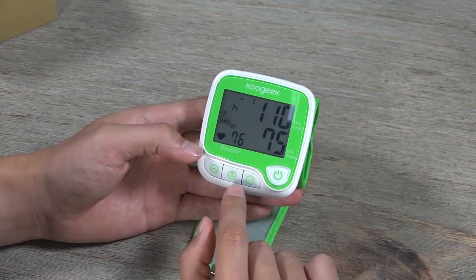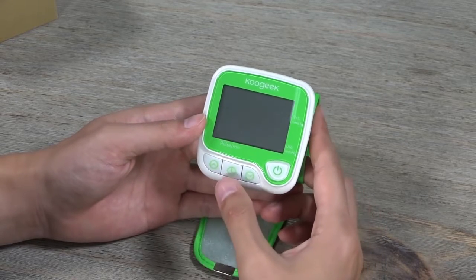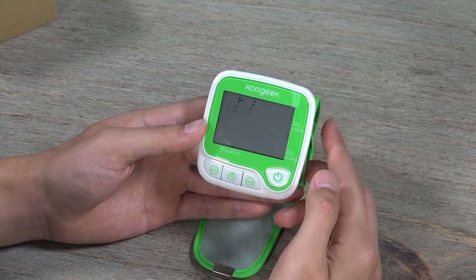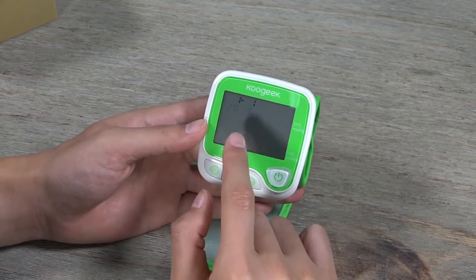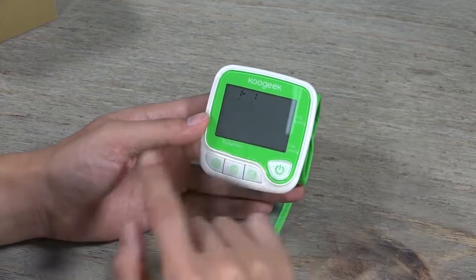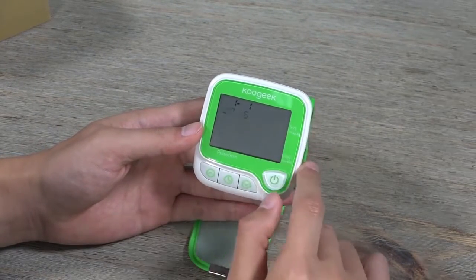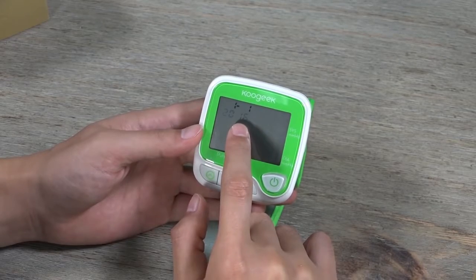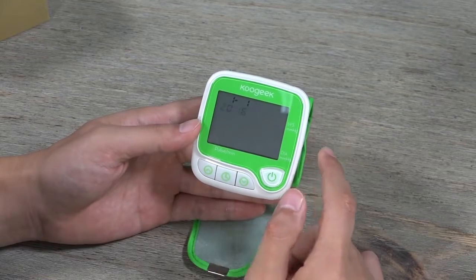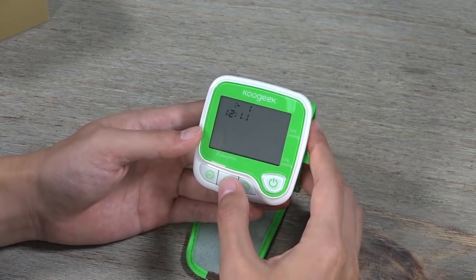This button is for you to see the average of your measurements. If you press and hold it longer, you get to change the time of the device. You need to know when you had taken your blood pressure, and you can also set a time to activate the alarm function.